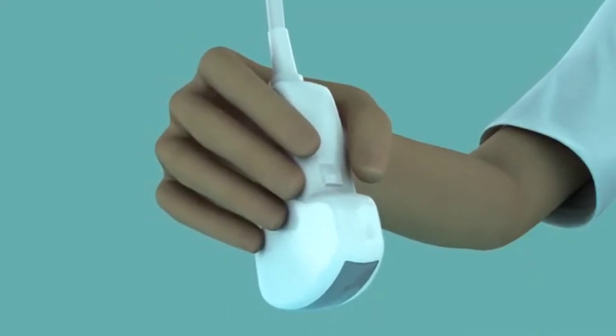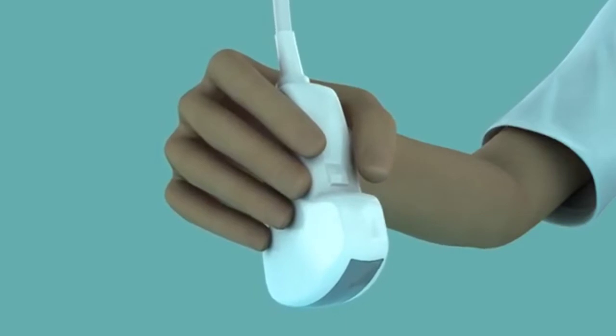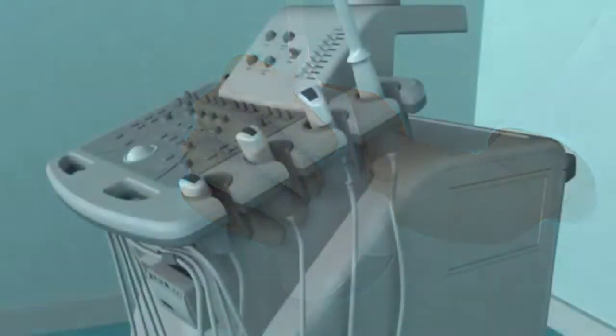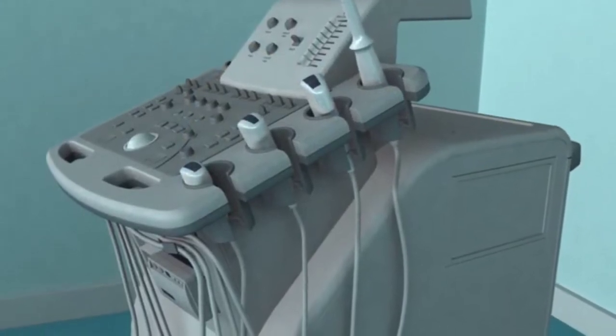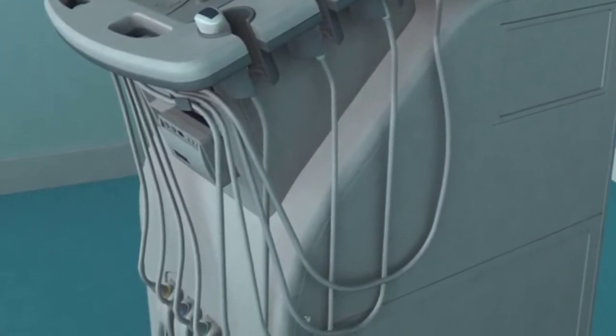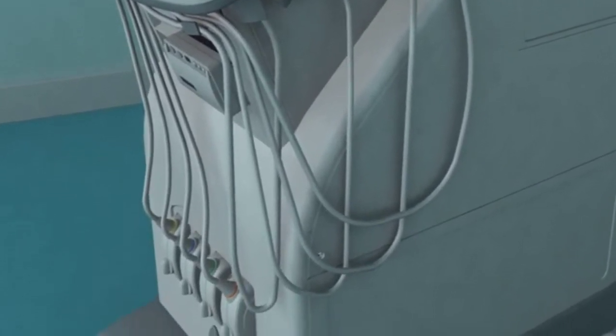The piezoelectric crystals within the probe are very fragile. The probe is the most delicate and expensive part of the machine and should always be handled with care and stored correctly when not in use. The cable connecting the probe to the imaging unit is also vulnerable to damage if not looked after.